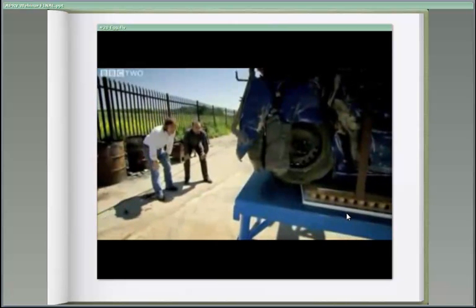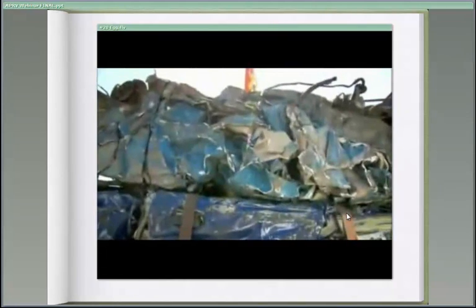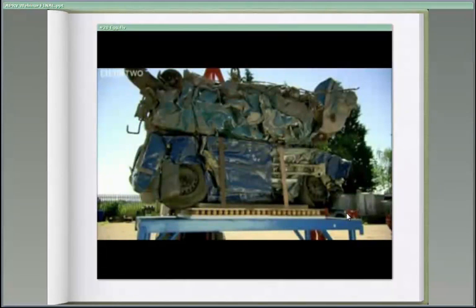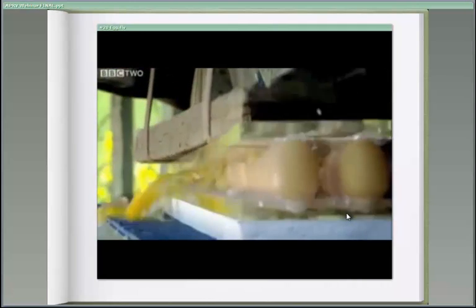Recruitment may actually be very important. We think recruitment may stabilize the lung and decrease the stress. Thanks to their double arch, the eggs are supporting over 1.5 tons. But the bigger the area, the load is going to be less magnified.